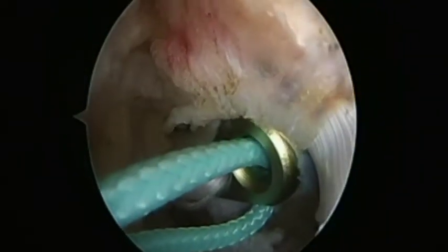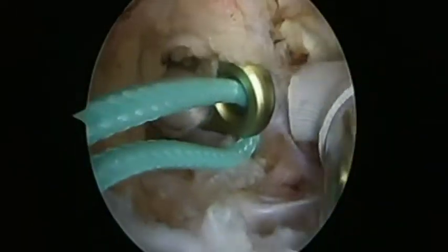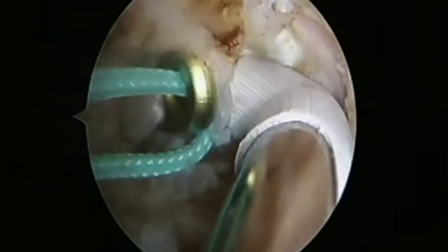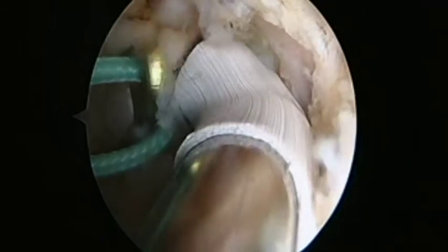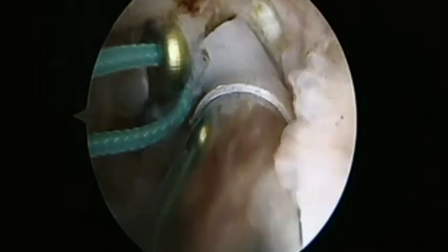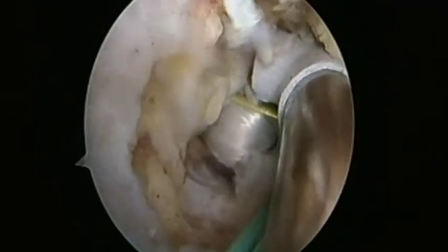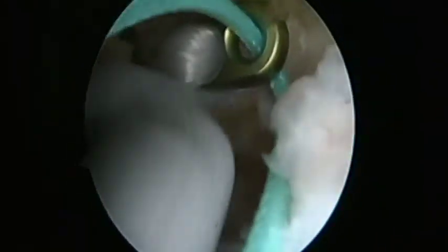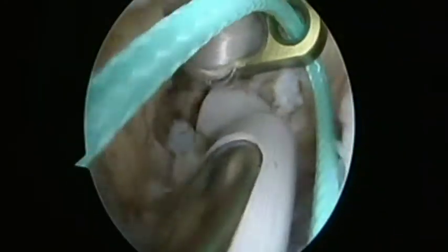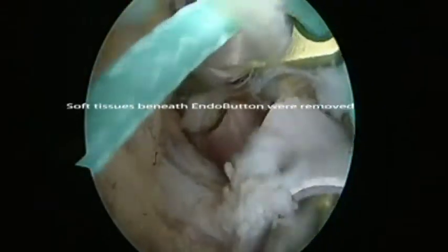Next, the endobutton of the PL graft was confirmed, and the soft tissue surrounding the endobutton of the PL graft was removed. The soft tissue beneath the endobutton of the PL graft was also removed to fit the endobutton to the lateral aspect of the femoral cortex by pulling the graft at the tibial side.